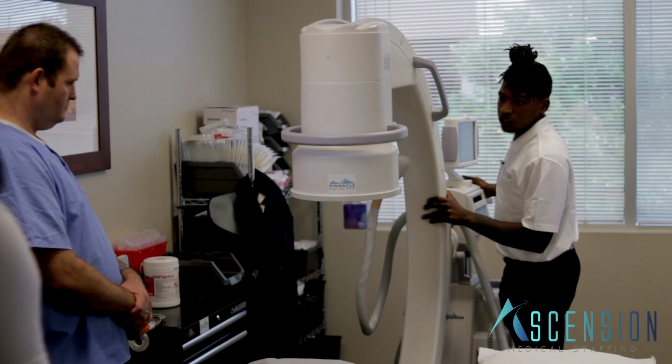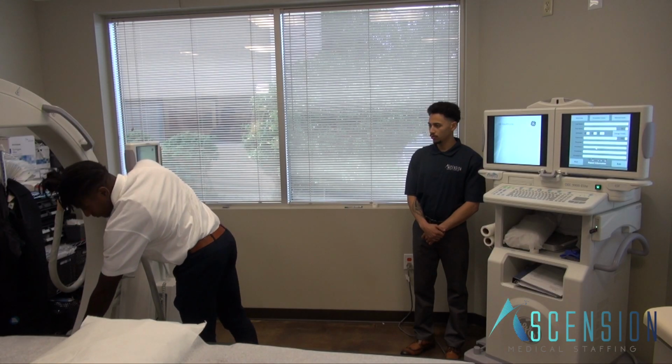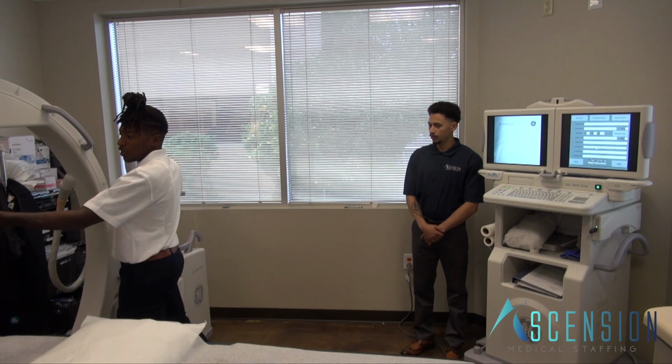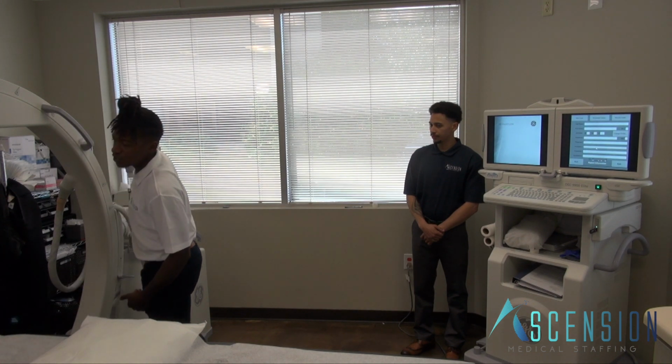And so we would swing it back to a PA position, posterior to anterior. Posterior is where the source of the x-ray is, down here. So we're coming from the source through to the II, and for anatomy purposes, that would be posterior of the patient through to anterior of the patient. That's what we call PA position. And then from there, you're sitting, waiting for the physician to finish up the contrast dye, and then placing the steroid injection, or the medicine, if you will. But that would be a SNRB.